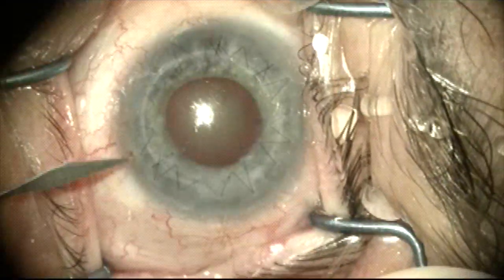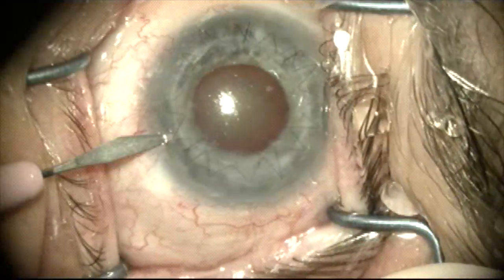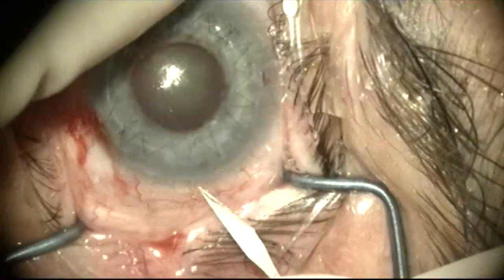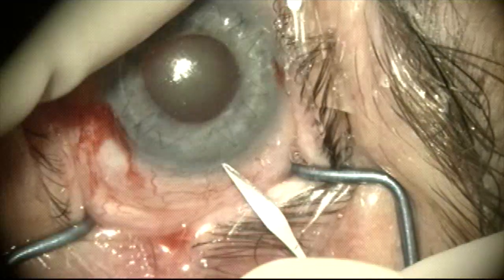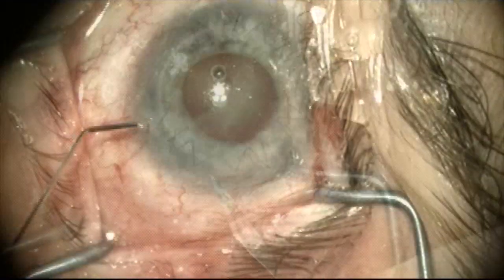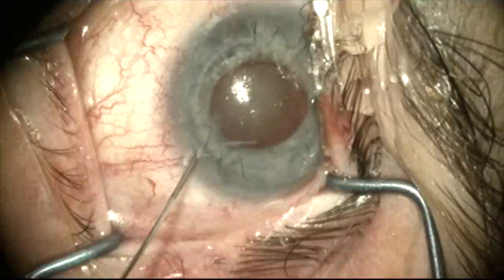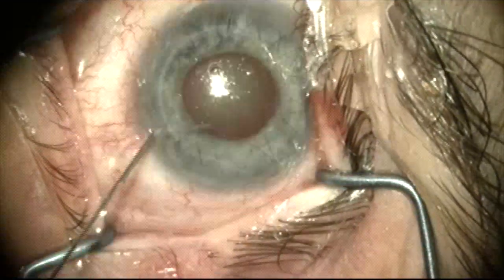This is a monocular patient with congenital glaucoma. He has a large buphthalmic eye. He has had a previous penetrating keratoplasty in this eye done one year earlier and now has a dense nucleus sclerotic cataract that we are doing surgery on.